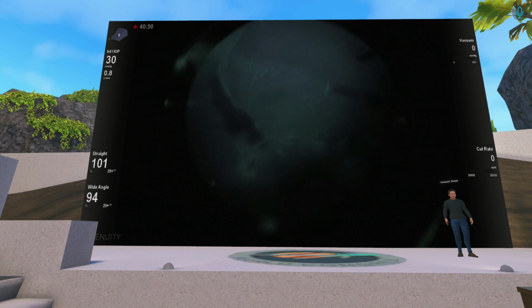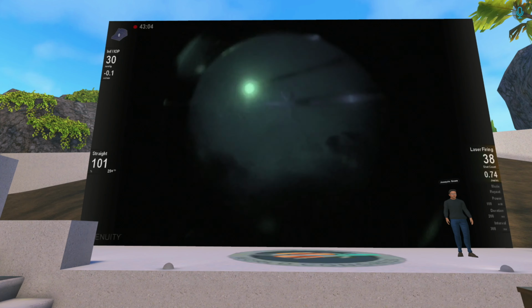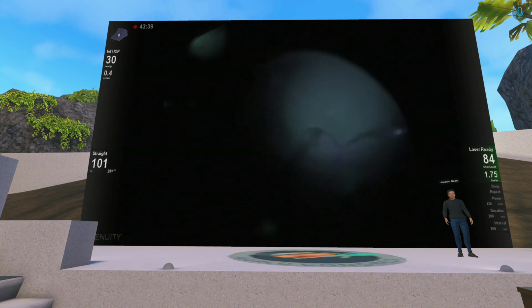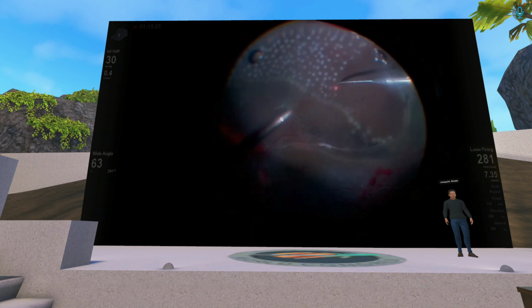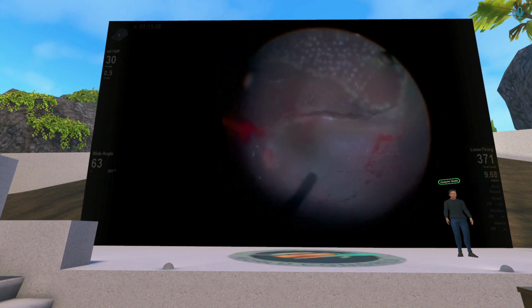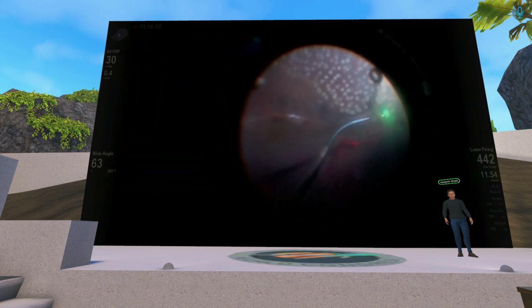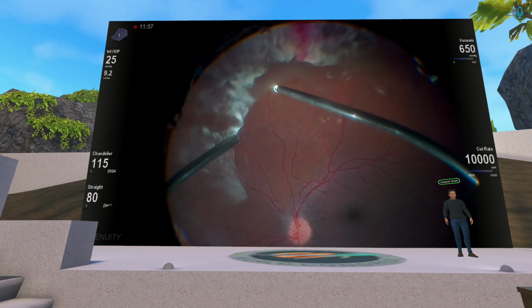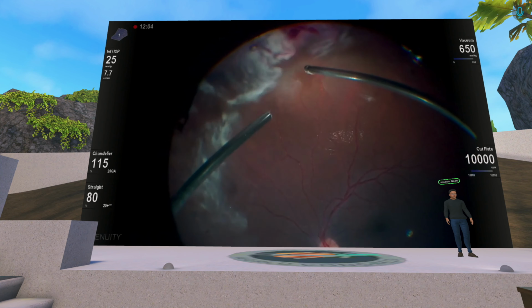Just on this baby, it looks like you left a little bit of that vitreous. Did you wind up taking all that out, or just leaving that area that was kind of difficult to tell what plane you were in? No, we actually left it like that. The patient is actually doing very well. It's all attached. So sometimes less is more, on the eye. Yeah. Less is more. The patient is fine right now.